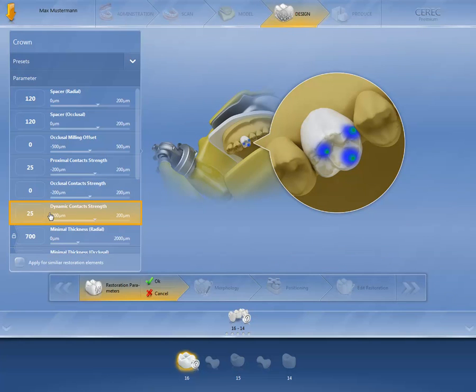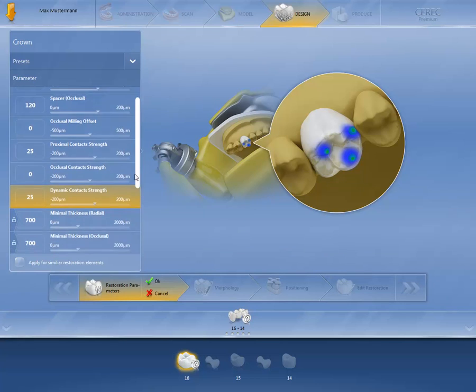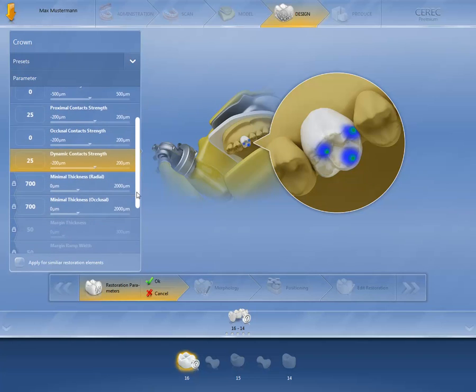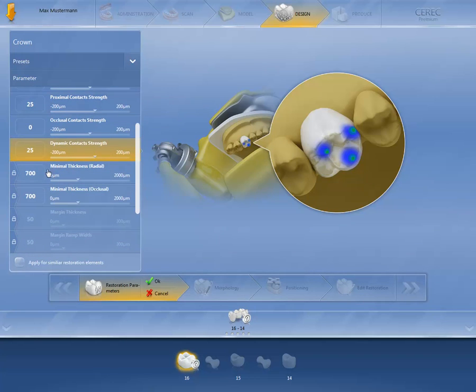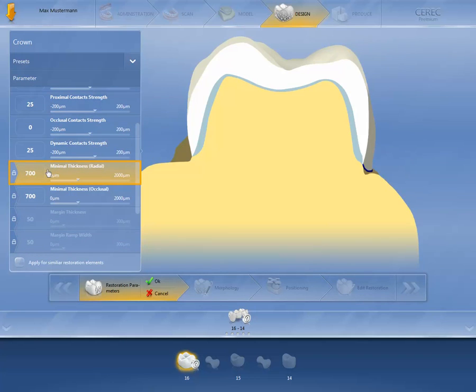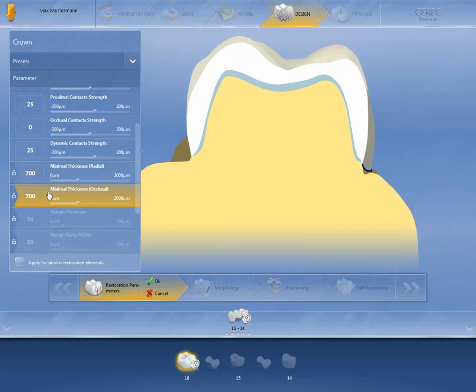Dynamic contact strength describes the contact during lateral movements in the mouth. The minimal radial thickness depends on the material — 700 microns is appropriate for the zirconia used here. The same applies to the minimal occlusal thickness.